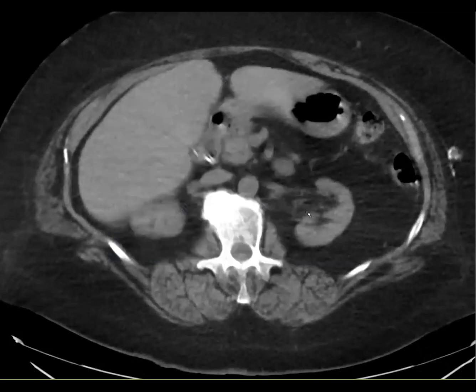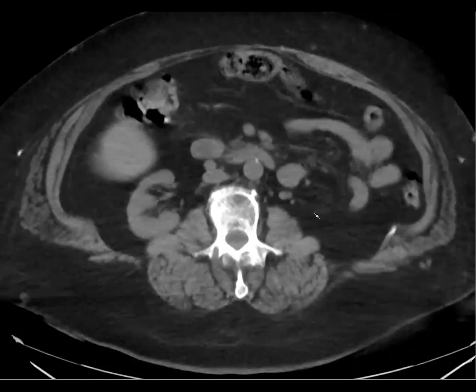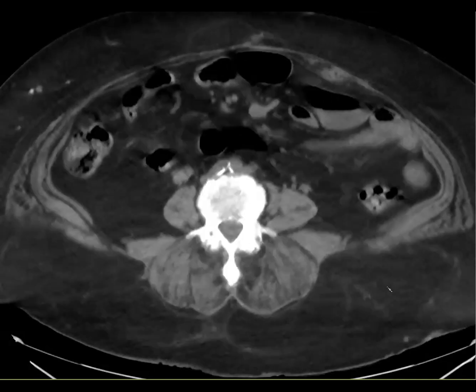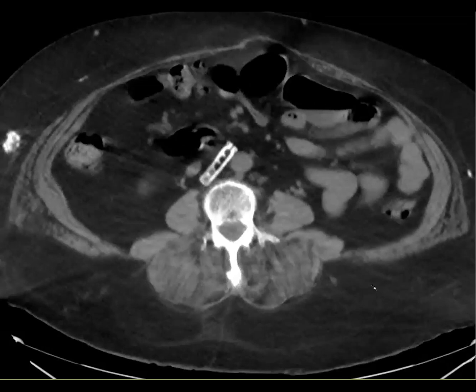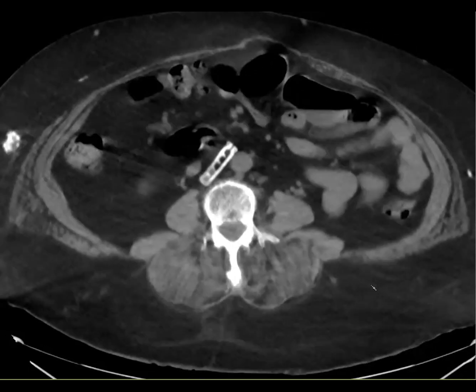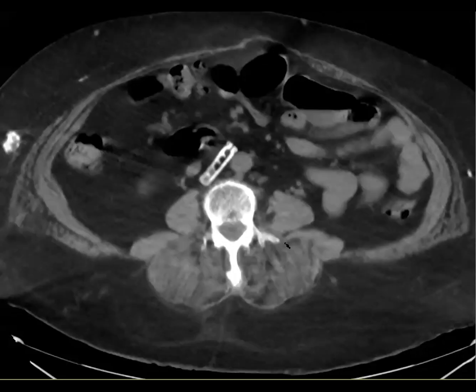Okay, great. So this is just a cute one, and audience participation. What do you guys think about this? IVC clamp. Iatrogenic. Do you know the name of it? I think it's called IVC clamp. It might have an eponym too. Yeah, it's called an Adams DeWeese clip, but Victoria, I agree with you.